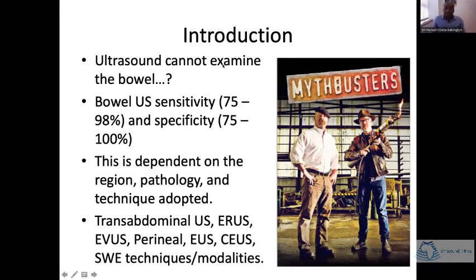I think by now we can all agree that that's a myth. With newer technologies and lots of training, we can definitely examine the bowel at a competitive level to CT and MRI, actually. But this is very dependent on the region that we're scanning, and also the pathology and the techniques we adopt. And we went through the techniques.